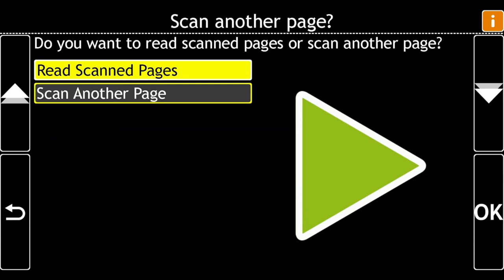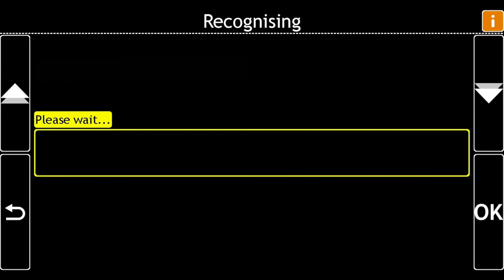Do you want to read scanned pages or scan another page? If you have more pages to scan, choose Scan Another Page, or choose Read Scanned Pages. Your text is being recognized, please wait.